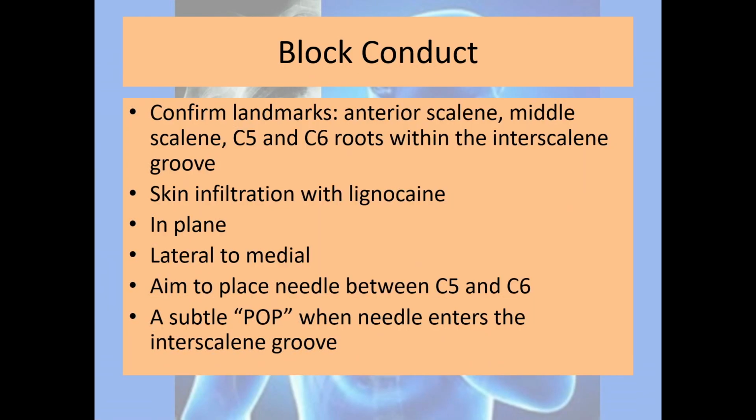So how do you conduct the block? First, you confirm the landmark via ultrasound, and then under aseptic technique, you do an in-plane lateral to medial injection, aiming the needle between the C5 and C6 roots. A subtle pop will be encountered when the needle enters the interscalene groove.